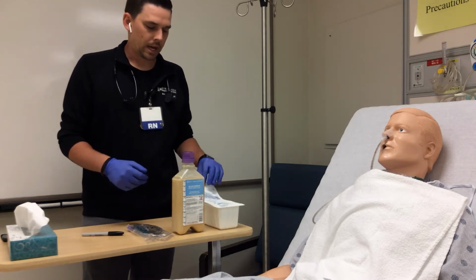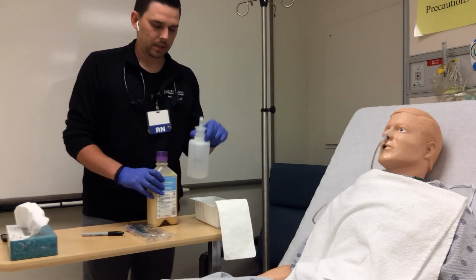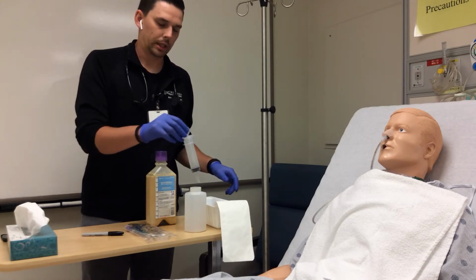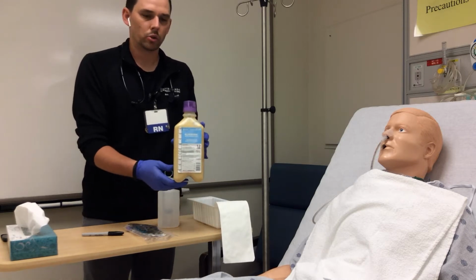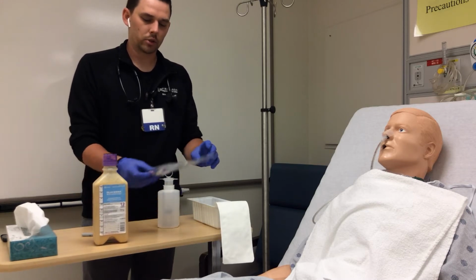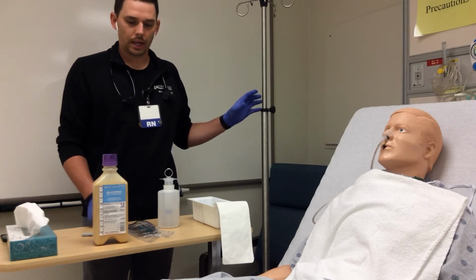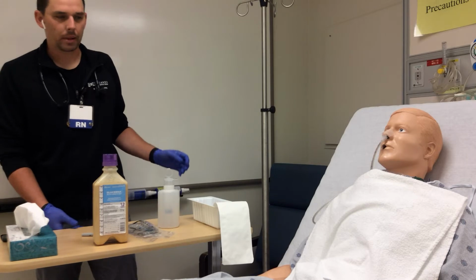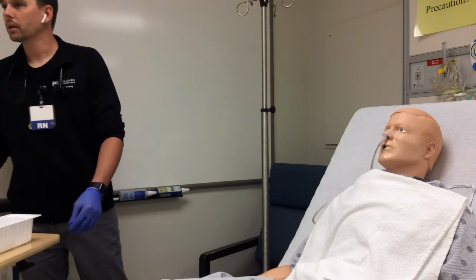So for this procedure, I have my irrigation tray, I have my basin, and I have my 60 ml syringe, and then we have some clean water available. I also have my continuous tube feed bottle ready to go, and then my continuous tube feed tubing. And then you're also going to have a tube feed pump that will be connected to your IV pole that I will demonstrate through pictures here in a moment.